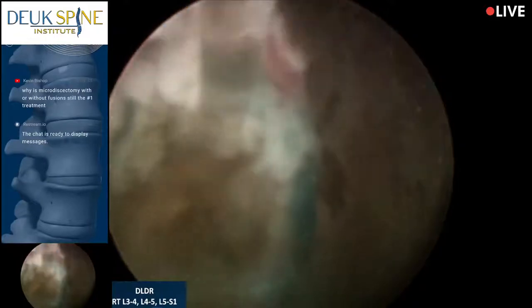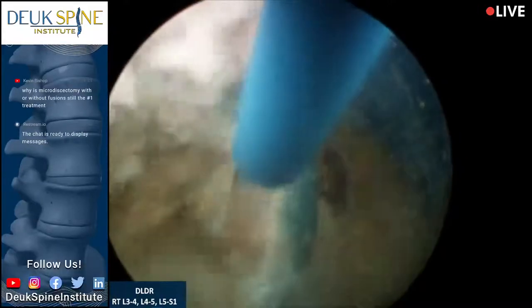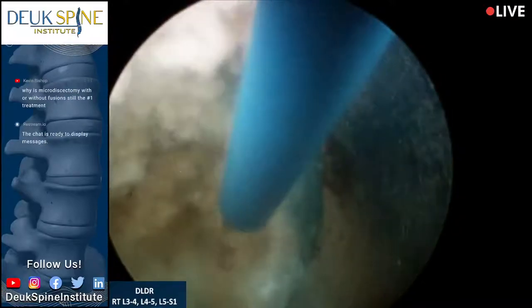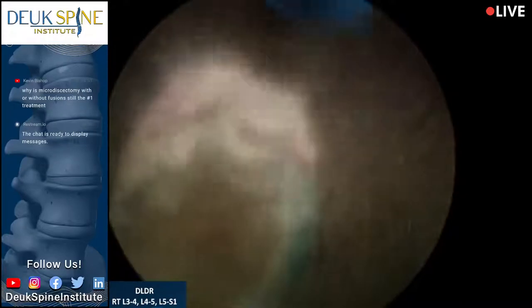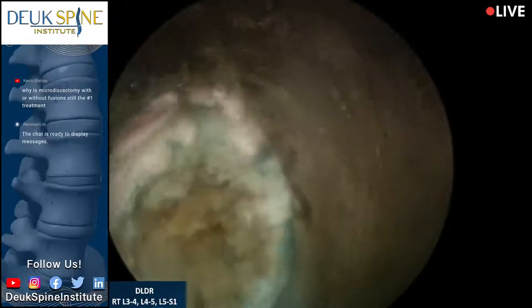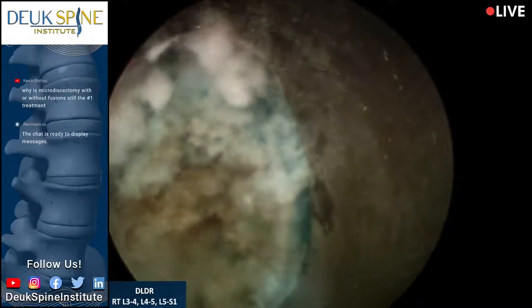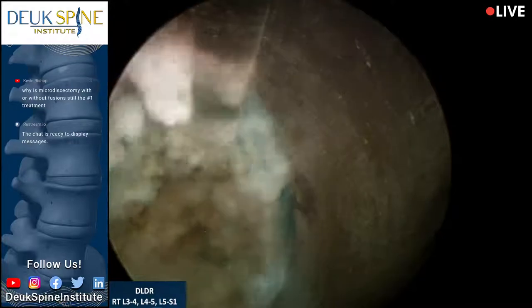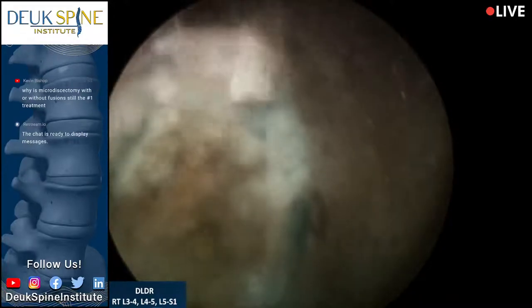Okay, we are at L5-S1, just wrapping things up. For those of you who don't know what that blue thing is, moving around at 12 o'clock, that is the laser fiber. And there's some blood vessels right there. You can see the little veins. And you see how the retractor is good at basically moving them over so we don't injure them. There's a limit to how much we can retract them, of course.